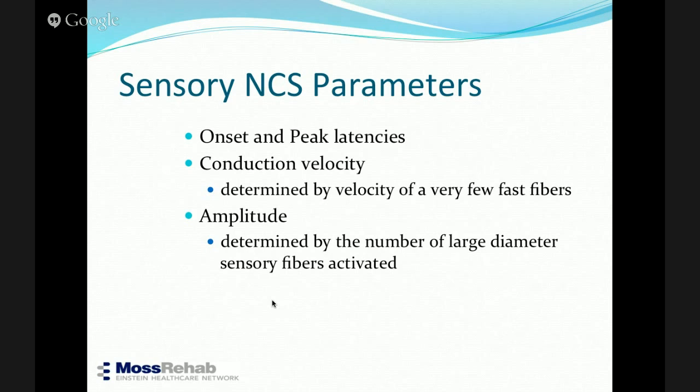However, if you want to calculate a conduction velocity to the peak point, you really are not getting the fastest fibers. So you're looking at some mid-range fibers which are coming in, and you're calculating a conduction velocity. So you cannot calculate a conduction velocity there. You can only look at a latency. So again, the conduction velocity is by the fastest fibers, and that has to be by the onset latency.